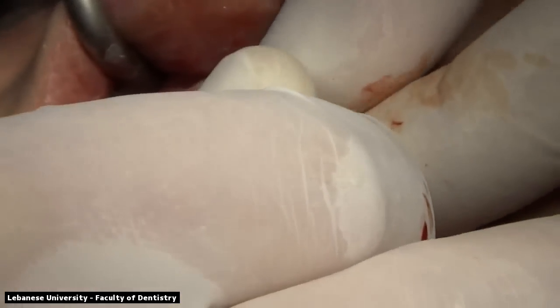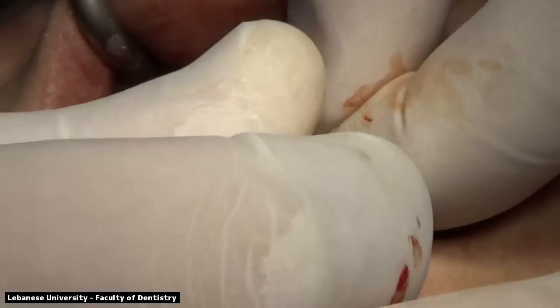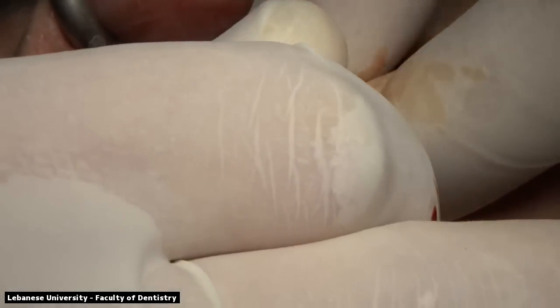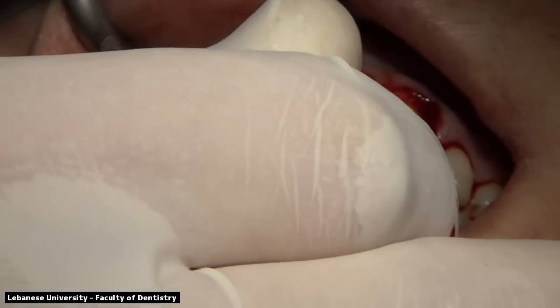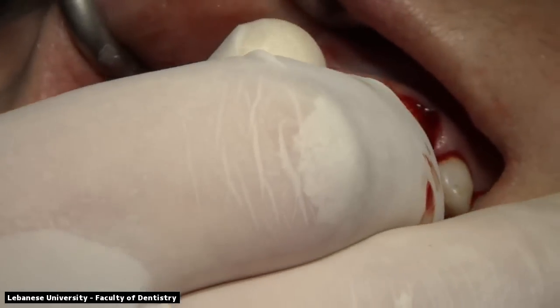While the mount is placed, we are placing the other implants so that they are parallel to each other in a proper direction. We're also inserting them by hand. We start off with the mount and the hand wrench, and then we move to the torque wrench so that we can complete the insertion of this implant.